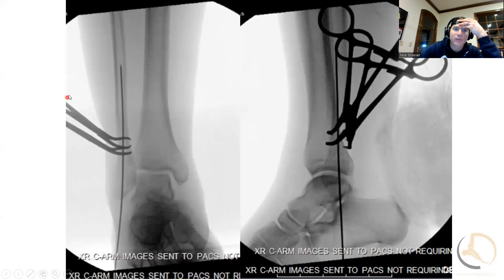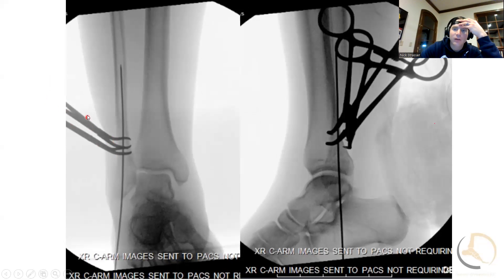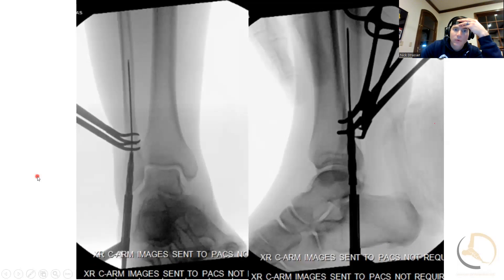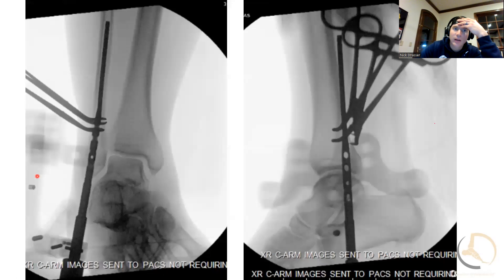For those who haven't seen a lot of nails, if you look at where my clamps are, they're headed proximal — they're sitting proximal. That's because you want to make sure you put the clamps on that way, because otherwise the jig will get in the way of passing the nail. Then measuring the reamer — the distal reamer followed by the more proximal reamer — and then advancing the nail into place.